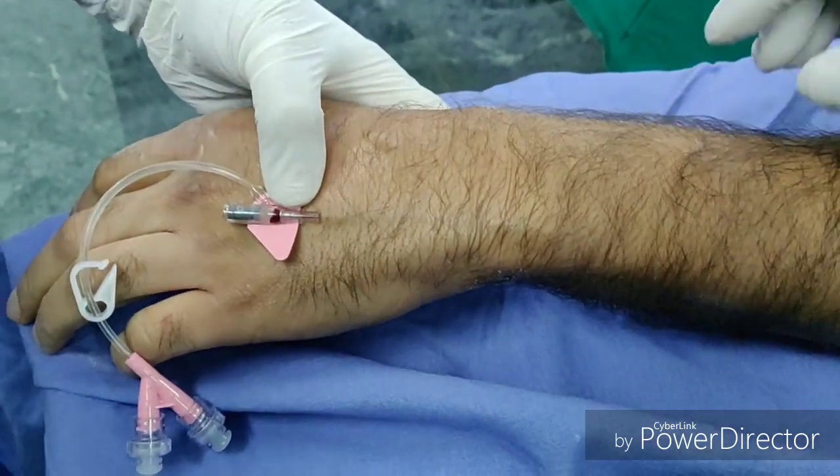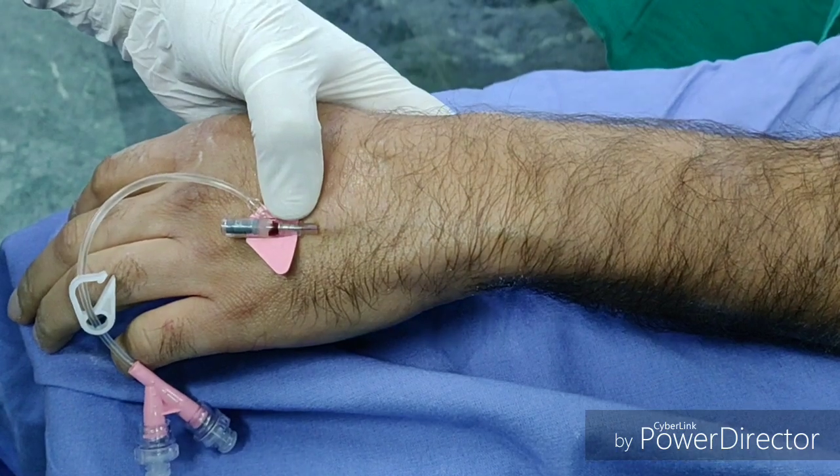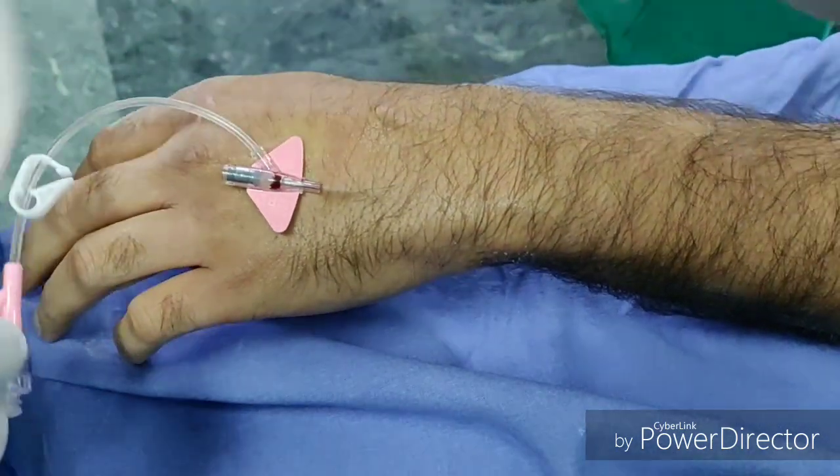The tourniquet is released and the needle is discarded in the sharps box. The IV cannula is now flushed with saline.